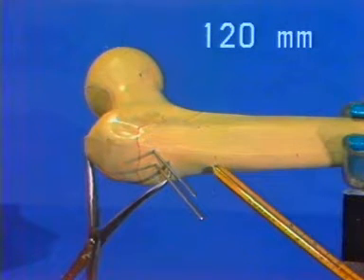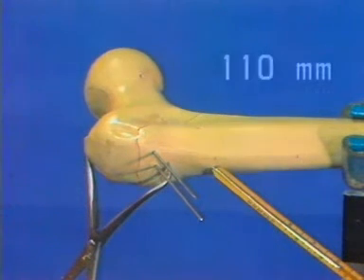This is demonstrated here. The hole should be drilled to end 10 millimeters from the joint and thus should be only 110 millimeters deep.